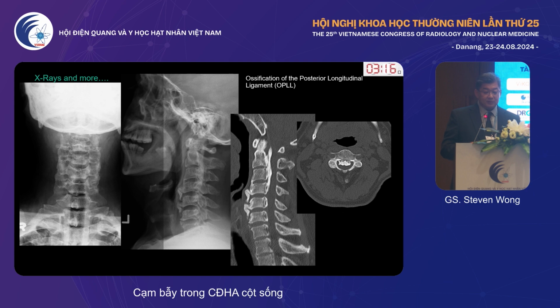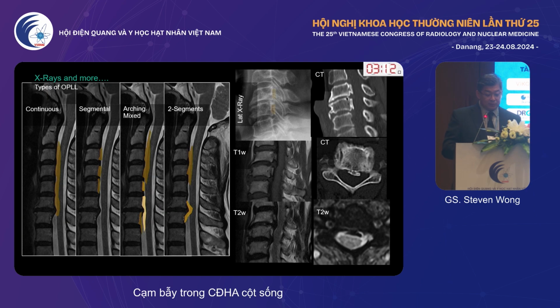OPLL is simple. Get a CT scan, look at it. The degree of OPLL is well reported. MR may actually underestimate the degree of stenosis of the spinal canal. And then there are different sort of OPLL, each with its own complexities and complications.